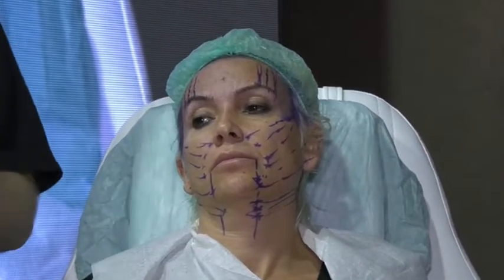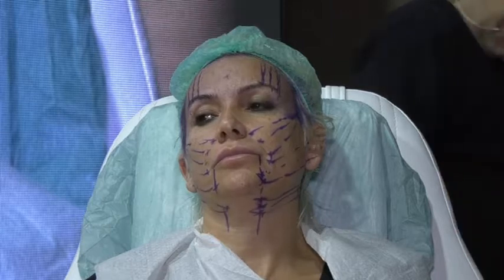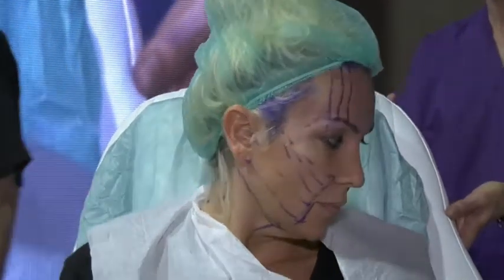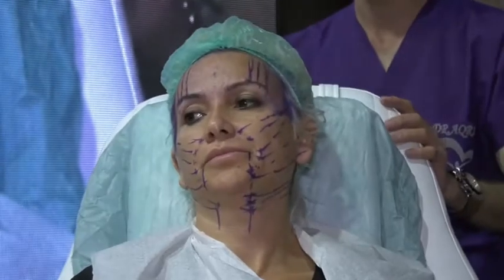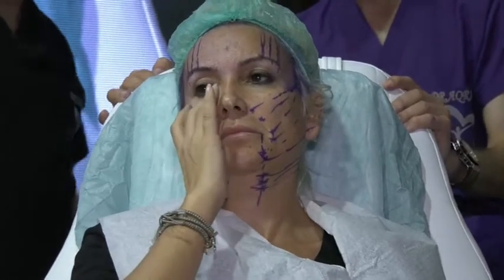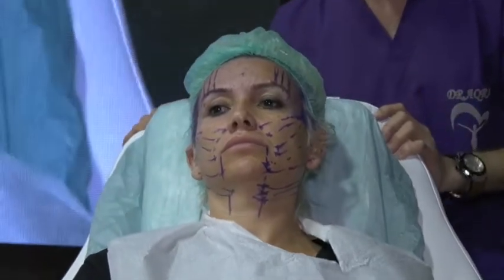Okay, let's do the disinfection and anesthesia. Any question before I start doing the application? Did you add sodium bicarb to the... Put little drops of sodium bicarb in each syringe, please. I will add sodium bicarb to the anesthesia, so it will be much less painful. Now we'll take 5 minutes of anesthesia.